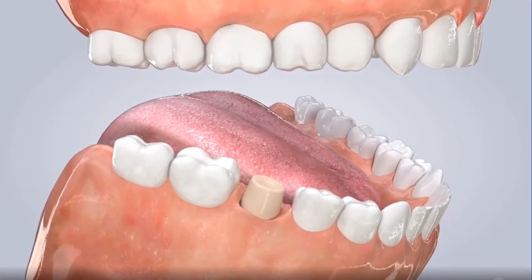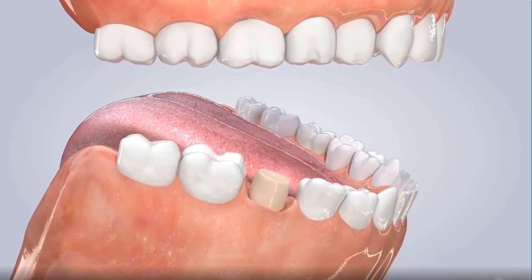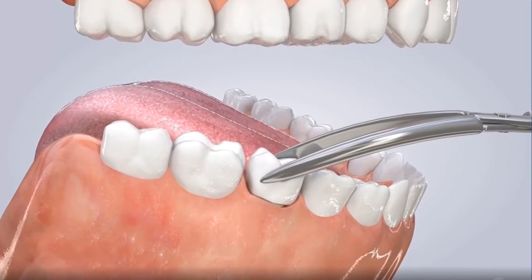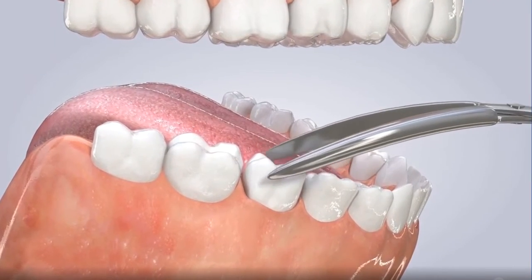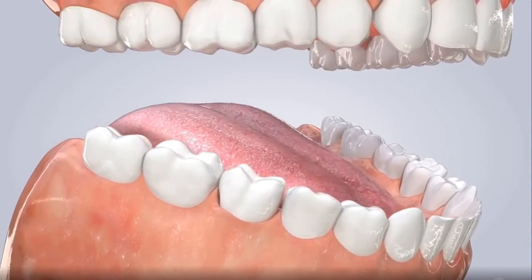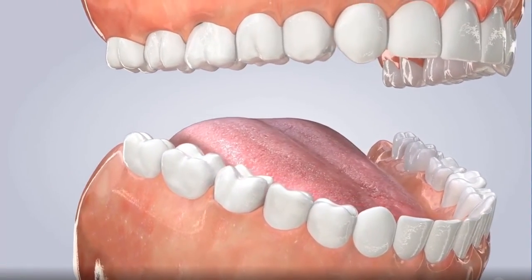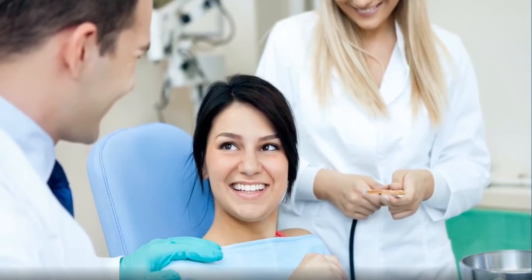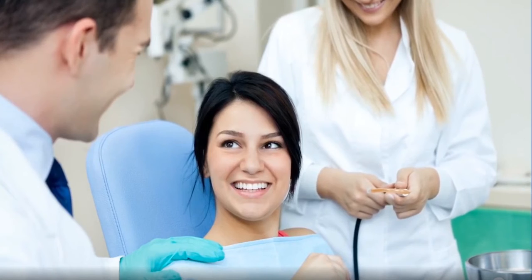Remember that the root canal therapy treats the diseased pulp of the tooth, but the treatment is not complete until the tooth is restored to a functional stage. This normally means a crown is required to restore the tooth's natural shape and appearance, seal the tooth, and prevent fractures. A root canal may require one or more dental visits, so don't be alarmed if your dentist asks you to return to complete your root canal treatment.